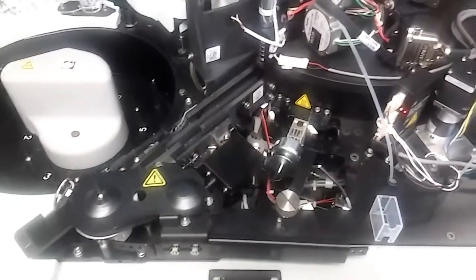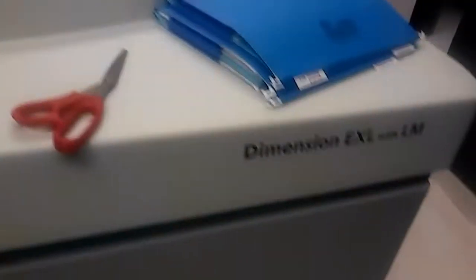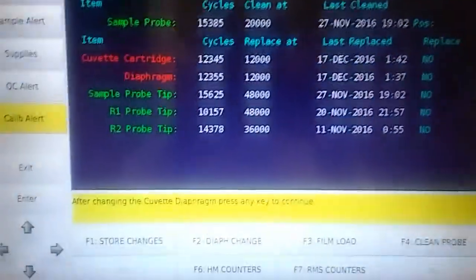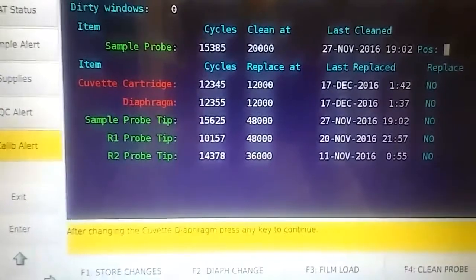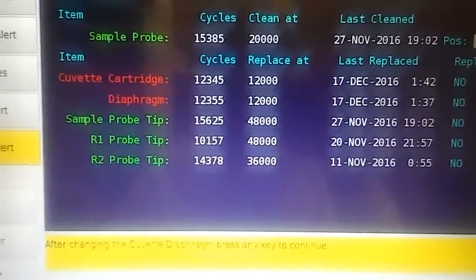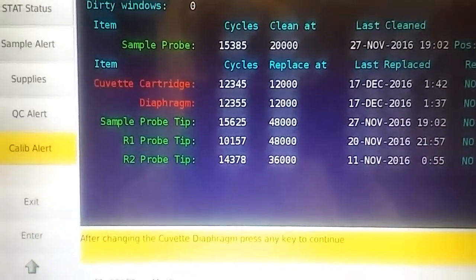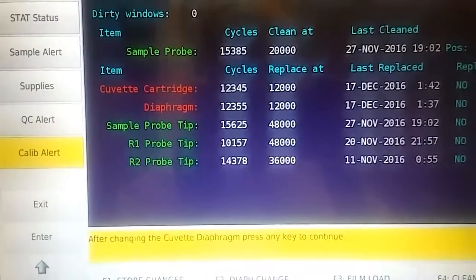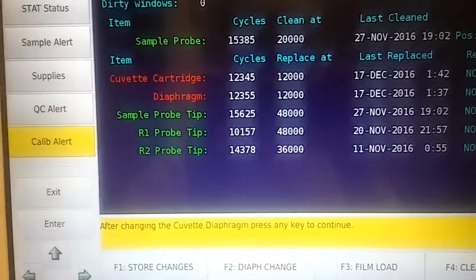I'm going to show you how to change the diaphragm on a Dimensions EXL with LM. First, go to your system counter screen. You can go anywhere from 300 to about 500 over. You really don't want to go more than 500 over the 12,000 because you have a chance of running into the black tape.